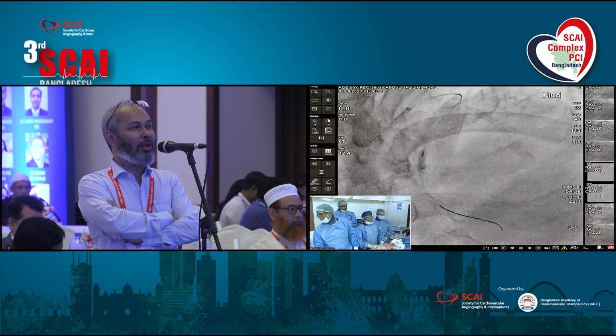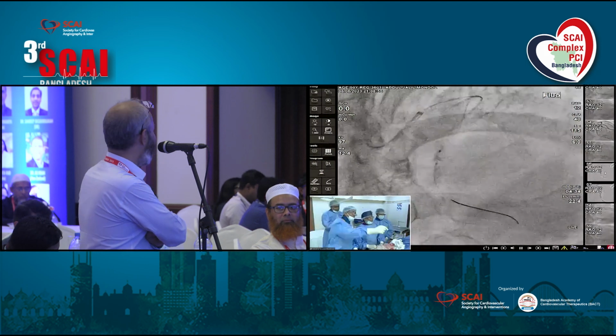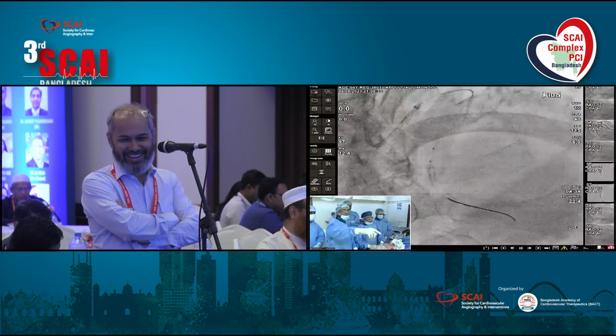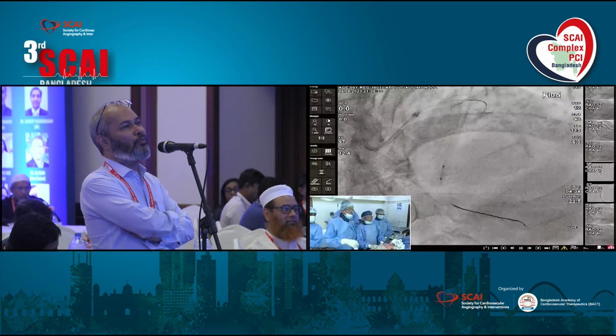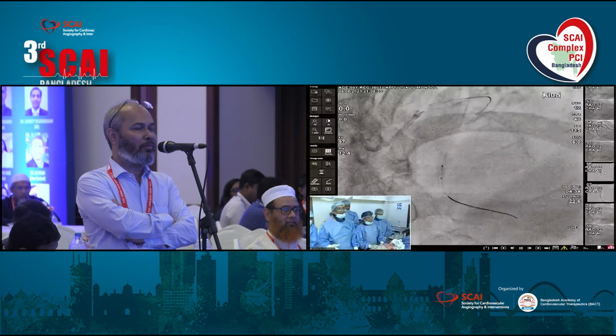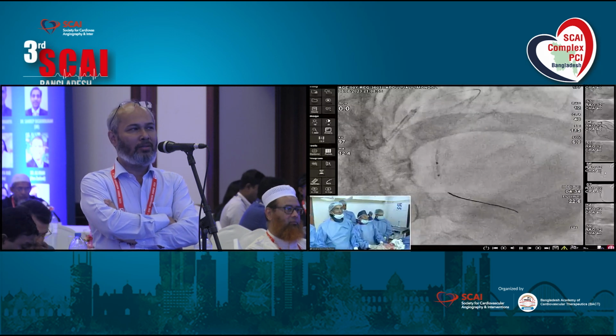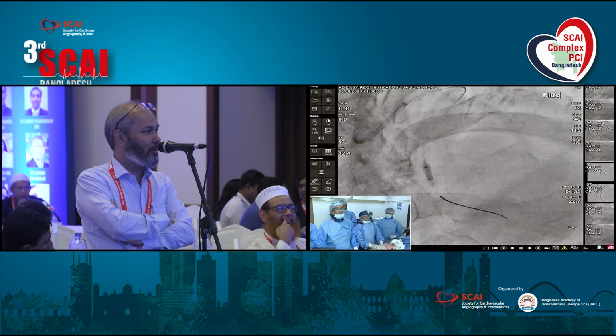Sometimes tangential. We love to see good things, not bad things, you know. That's why I'm telling you. We can show you in a left anterior oblique cranial view. If you want to avoid the LAD lesion, sometimes we prefer the cranial view to see it. You do not need to go for stenting, okay, it's okay.